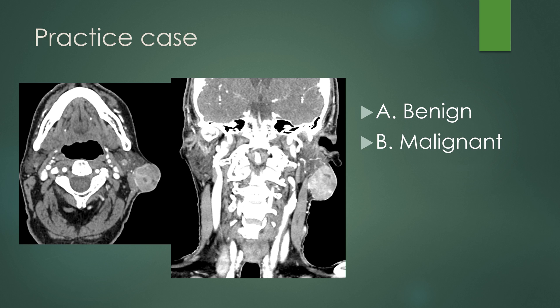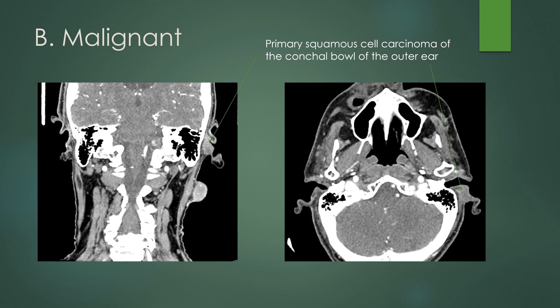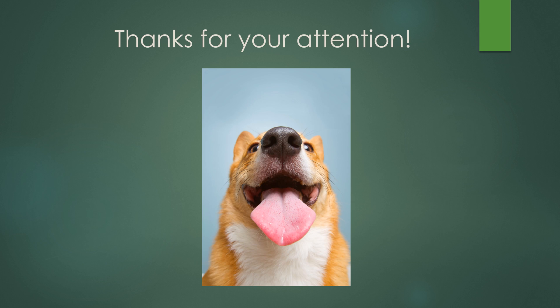For a practice case, you have this lesion in the superficial lobe of the left parotid gland. Based on the CT features, do you favor it being benign or malignant? The correct answer is malignant. If you look at the images, there is a primary squamous cell carcinoma of the conchal bowl of the outer ear, and these were metastatic deposits including in the left parotid gland. Here's the primary cancer, and here is another metastatic lesion. Thank you for your attention.